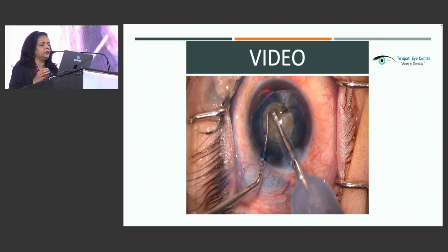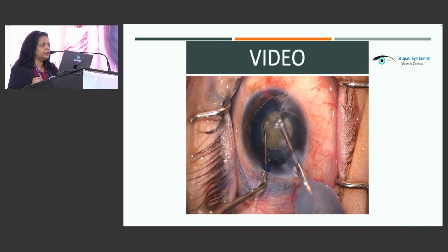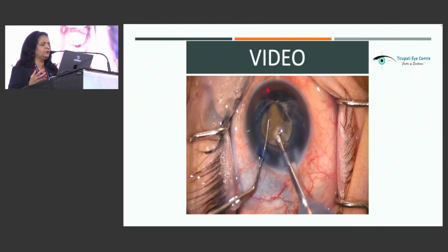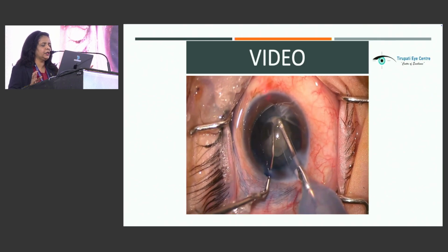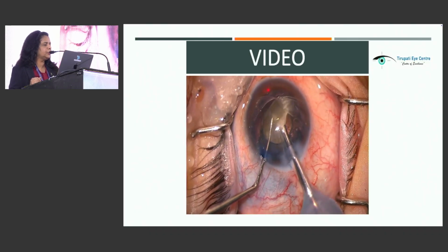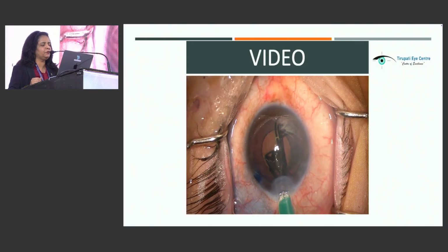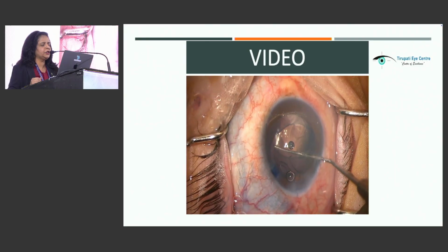And this is especially what I've chosen to show to you, a hard cataract today in this case, because even when we have tried in very hard cataracts also, even when we are maneuvering the pieces out, the rhexis does not rip apart. So it has a good strength. And as I said, we can choose how much of the size of the rhexis we want. For small people, we can even go for 4.5 or 5 millimeters of rhexis, followed by lens implantation.